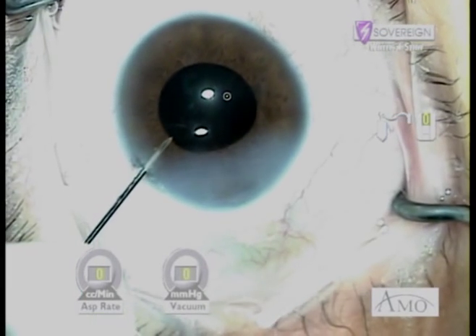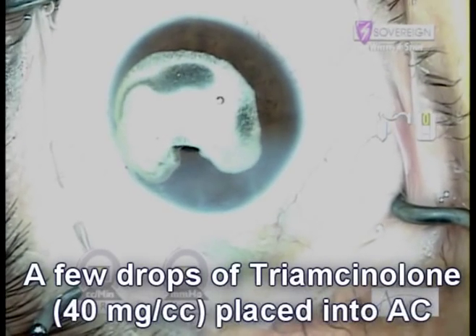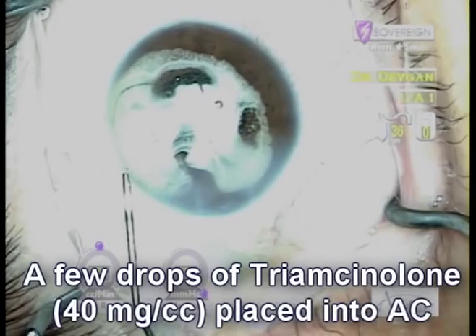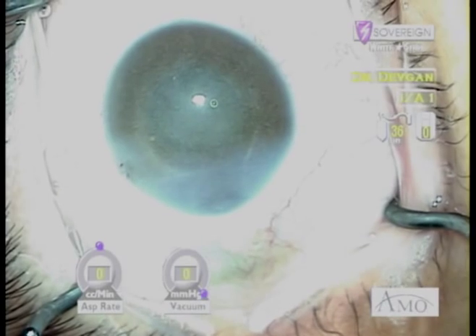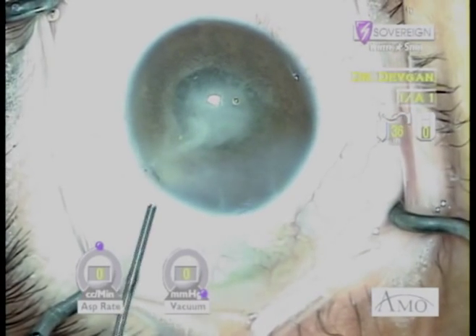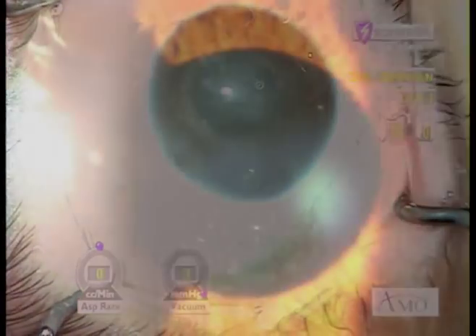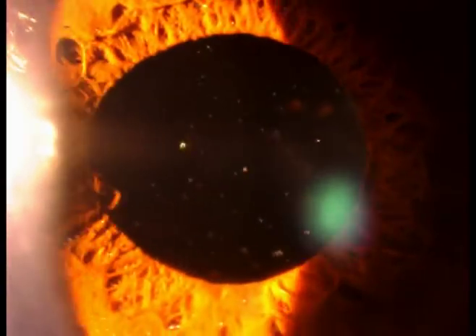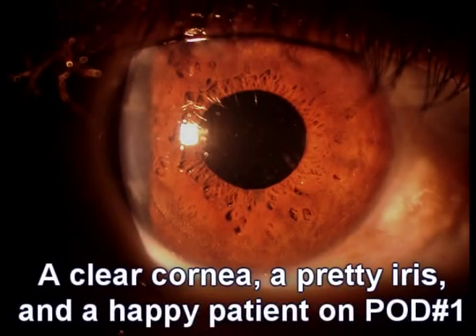Finally, we're going to add a little bit of Kenalog into the anterior chamber, just a few drops. As we spin this around with a little bit of saline, we can tell that there's no more viscoelastic in the anterior chamber. Additionally, if there was a leakage of fluid — as you'll see I create here the paracentesis — what would happen is the Kenalog particle would flow out and you'd see this stream. On post-op day one, we do see a little bit of Kenalog still in the eye, as well as a light dusting on the iris. But most importantly, the patient's happy with a clear cornea and a pretty iris.